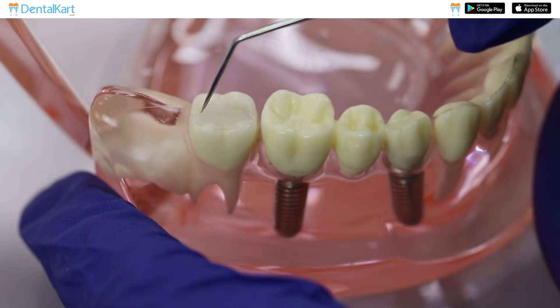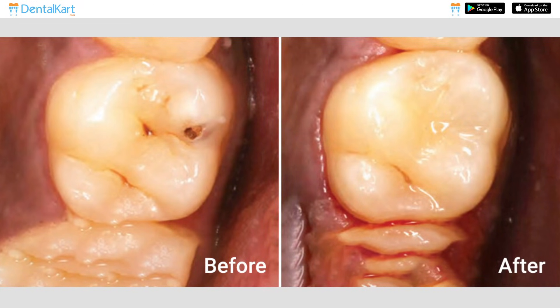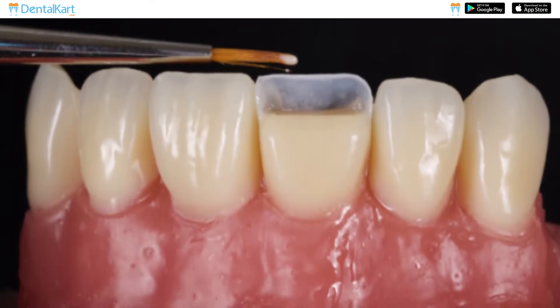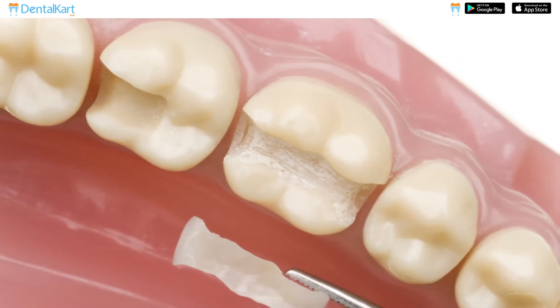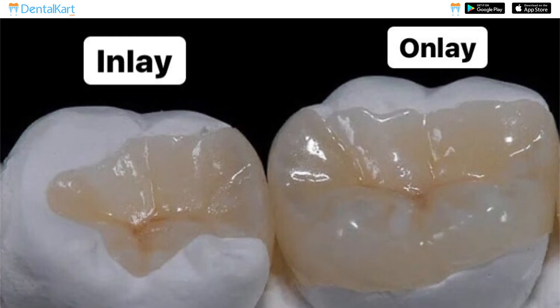This material has superior strength and natural-looking appearance, making it perfect for direct restoration of class 1, 2, 3, 4, and 5 cavities. It can also be used for indirect restorations such as inlays, onlays, and veneers.